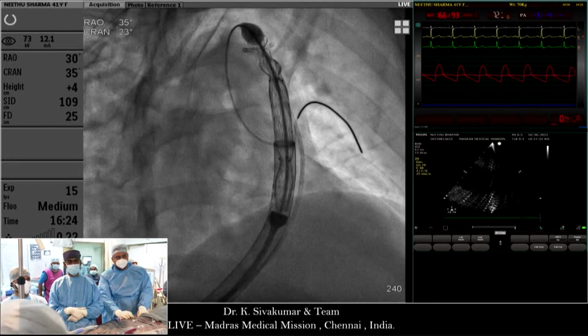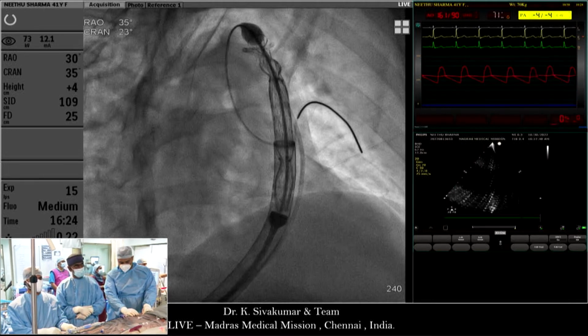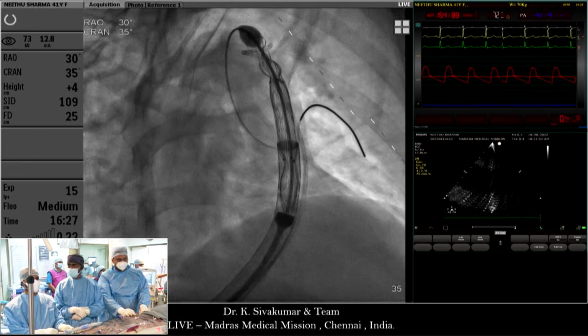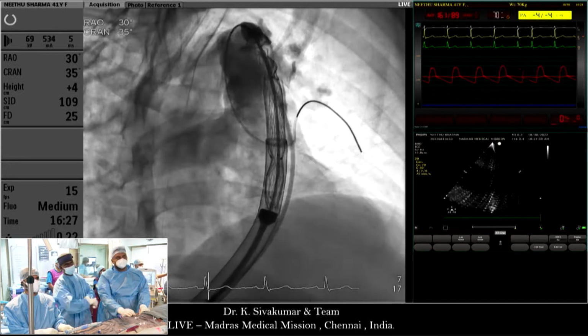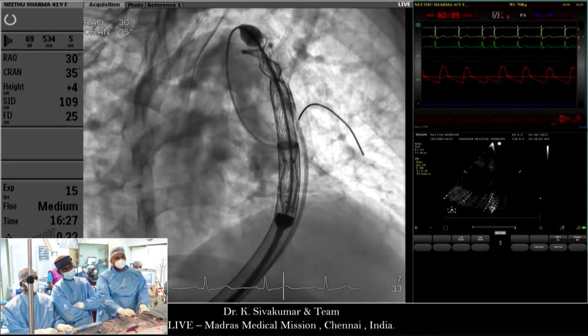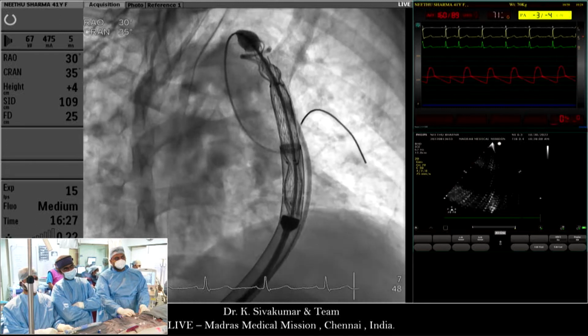And of course the most important are the angiographic measurements. Advancing the sheath and increasing the anteroposterior diameter, would that change the size of the valve that you will use? Remember he said that when you put the sheath in, the anteroposterior dimensions increase. I think I rely on the waist. I will rely on the waist. That's the key, I think.